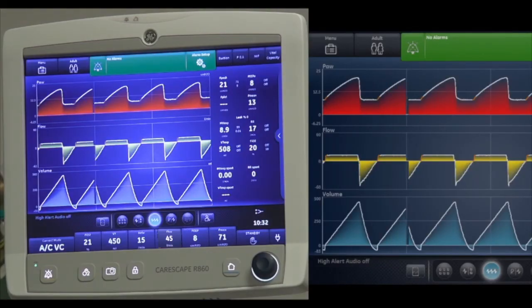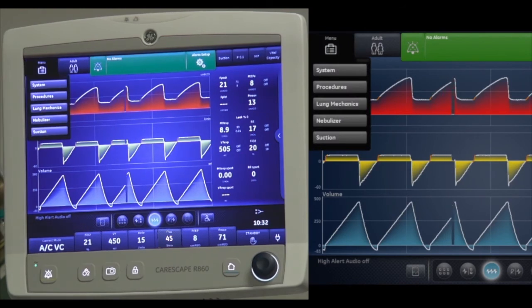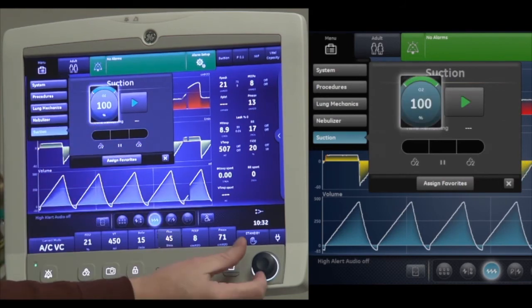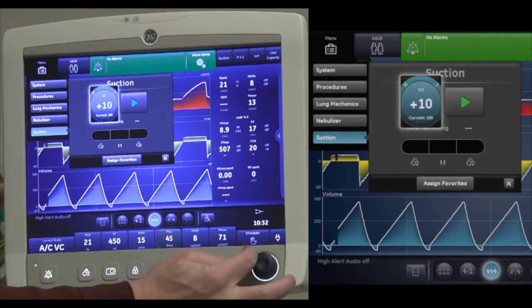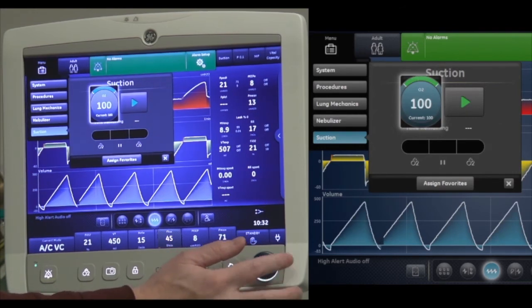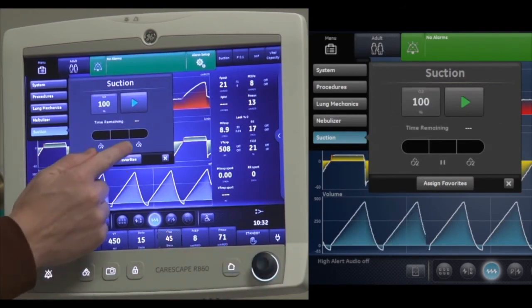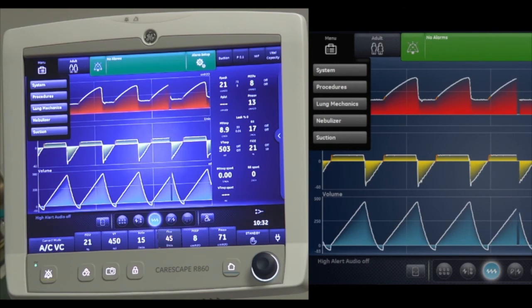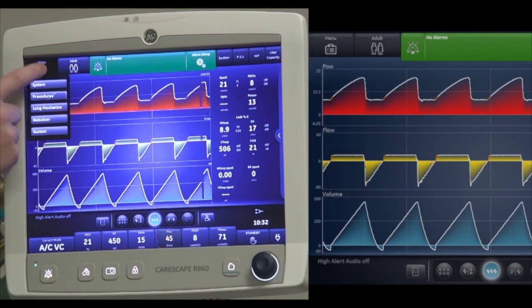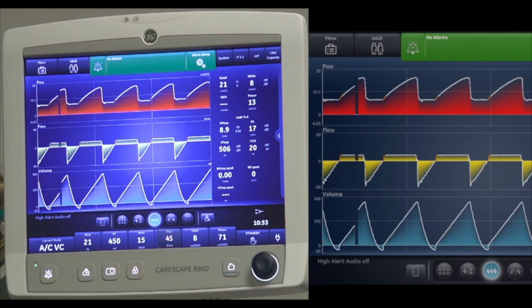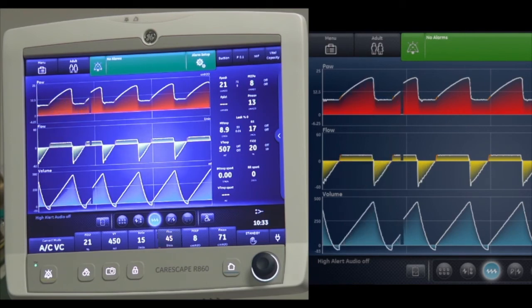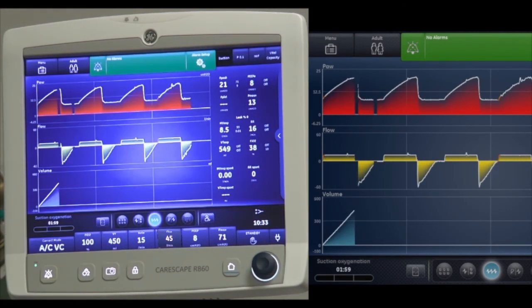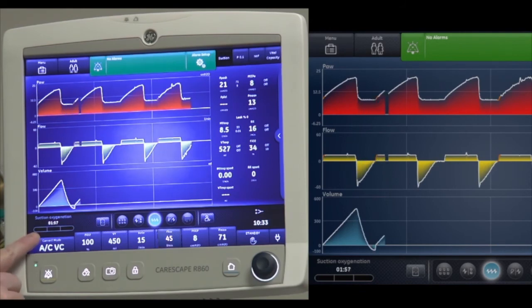To perform a suction procedure, touch the menu key and select suction. With the suction procedure, you can change the percentage of oxygen being delivered during the procedure. It can also be assigned to favorites. The suction functionality is designed as an open suction procedure, which is also useful anytime there needs to be a patient circuit disconnect. The suction procedure has three phases, visible in the general messages section of the display.